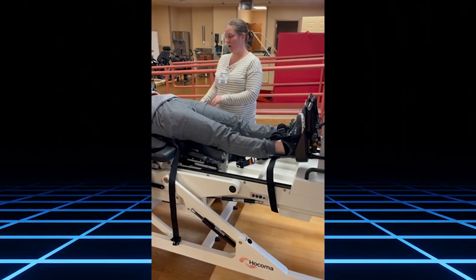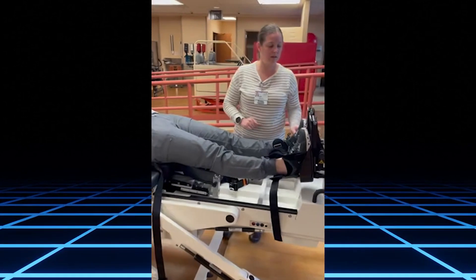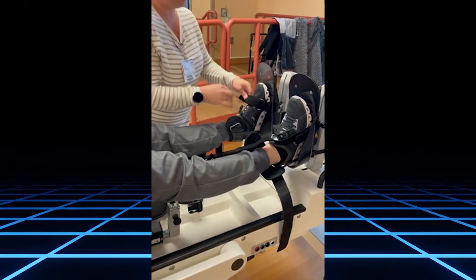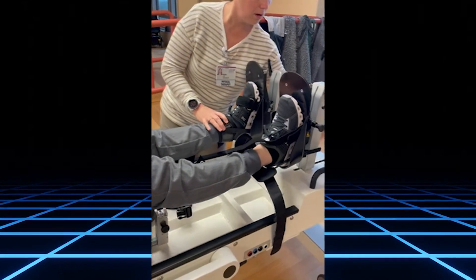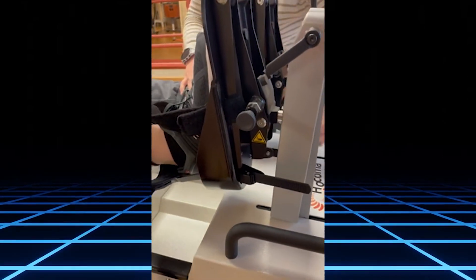You can start with either the feet or trunk. I will start with the feet and just begin attaching these. When you get to the ankle, there are straps here to tighten up the ankle so it's nice and tight on the foot.